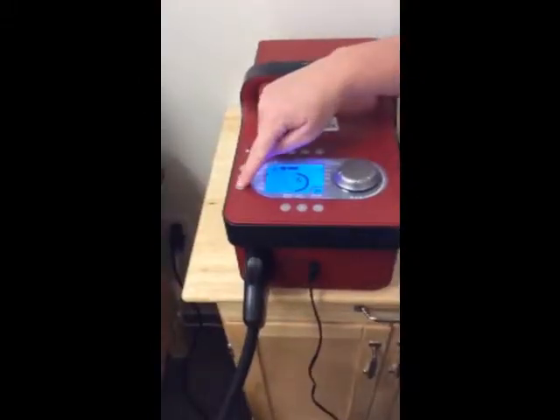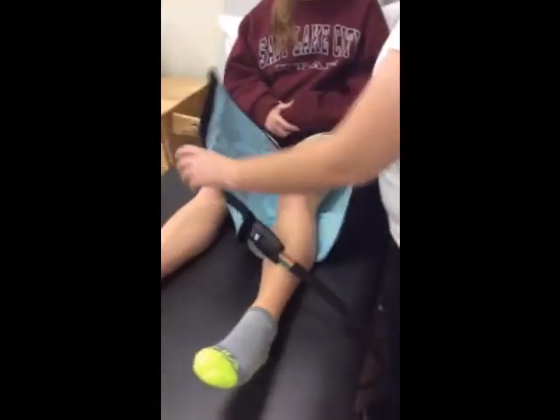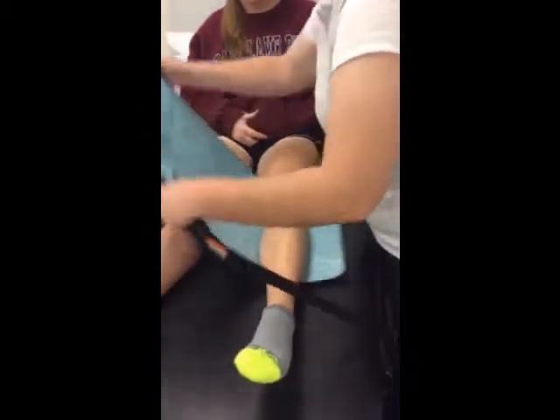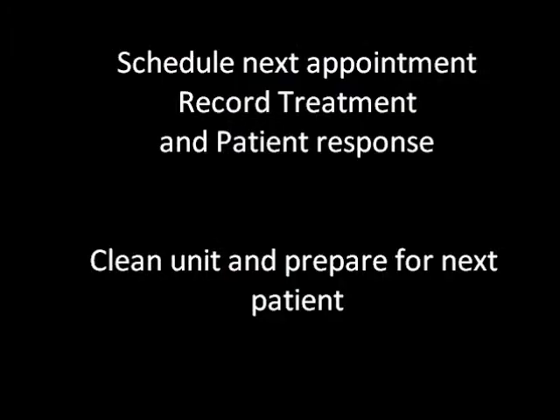If the treatment needs to be paused at any time, be sure to push the pause button before removing the sleeve. When the patient is ready to restart treatment, reapply the sleeve and push play. Any adjustments made to the treatment parameters also require the patient to press the pause button.